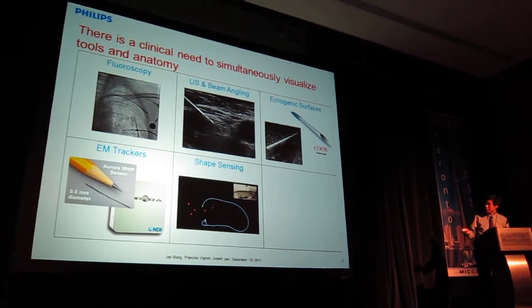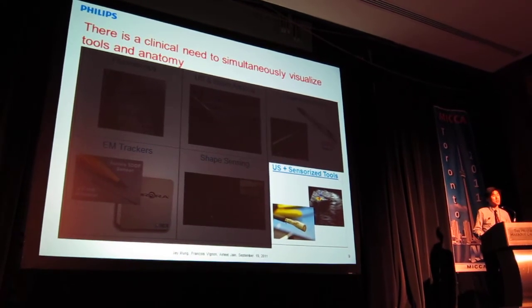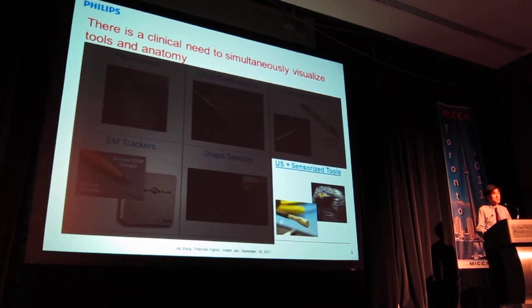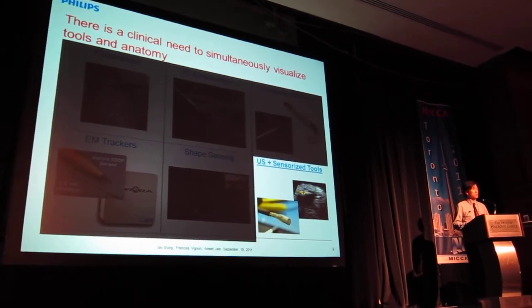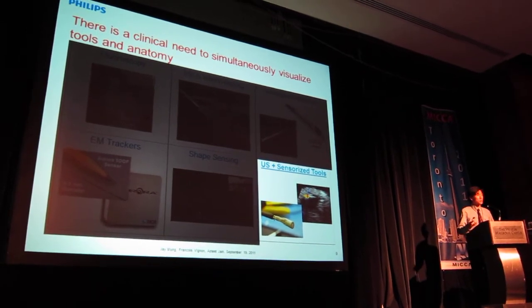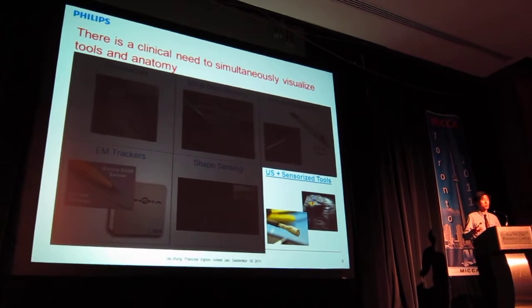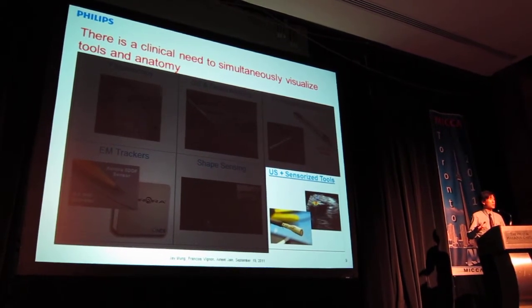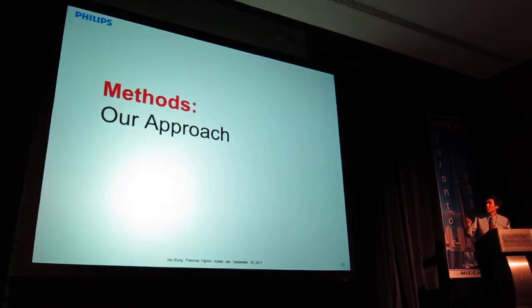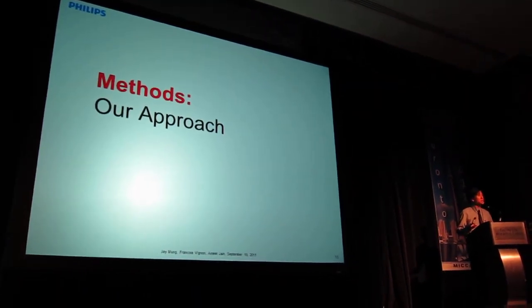But our approach is to use small sensors that we place on these interventional tools. Various attempts at this sort of approach have been made over the last 25 years or so. But with our work, we hope to show that we're the first to demonstrate real-time, robust, 3D accurate tool tracking using ultrasound only. So next I'll detail some of the technical aspects of the system.